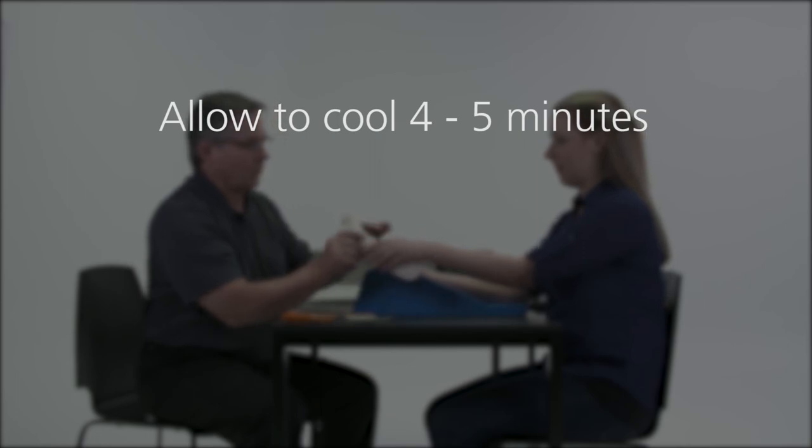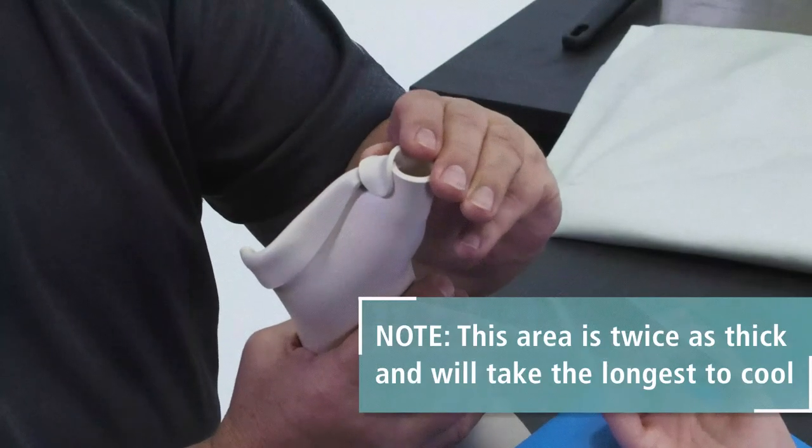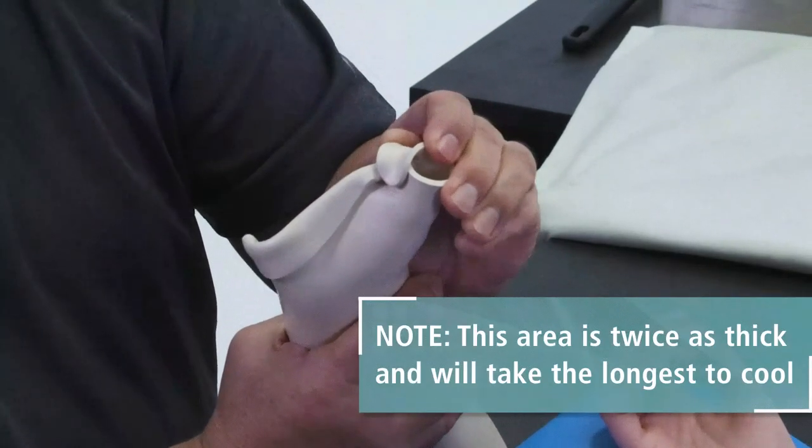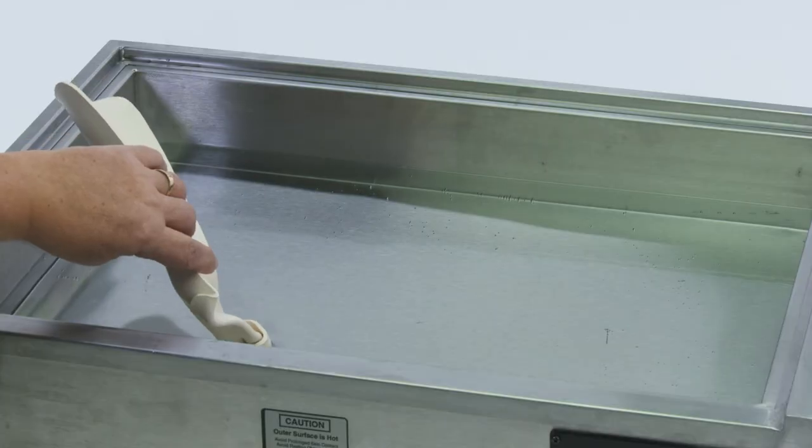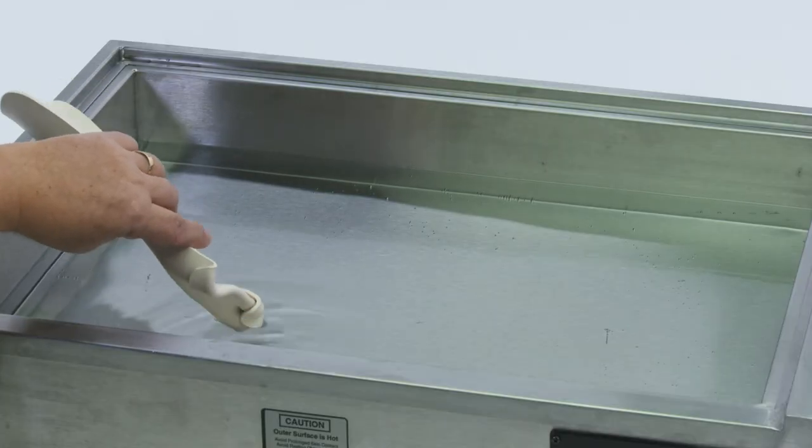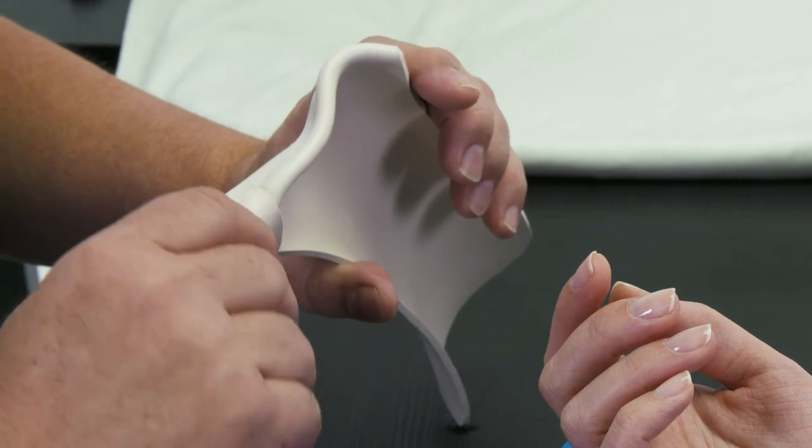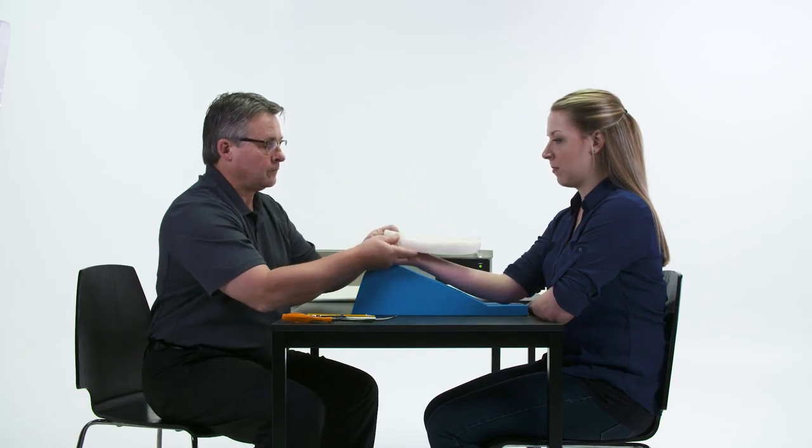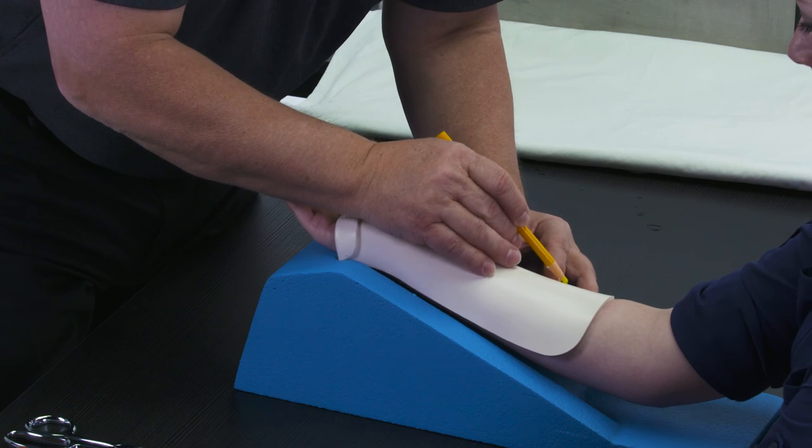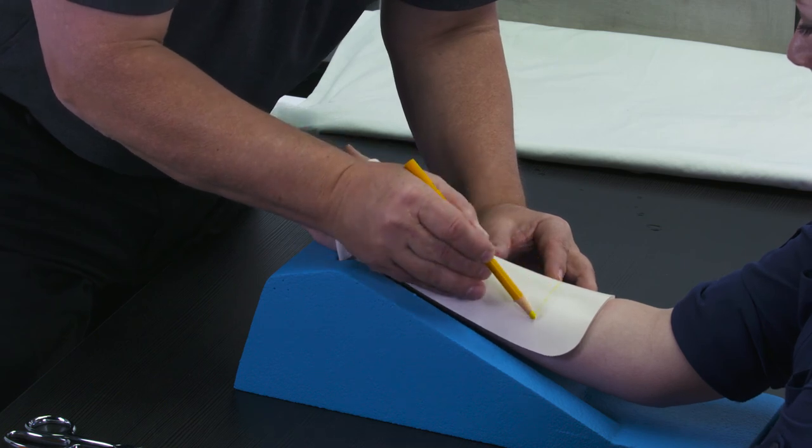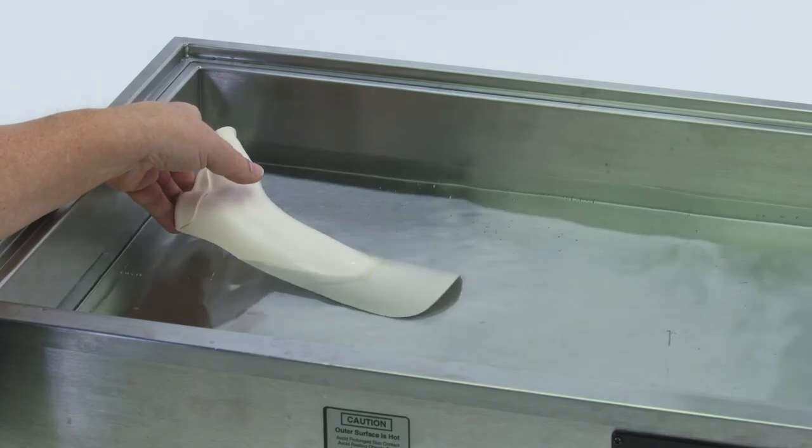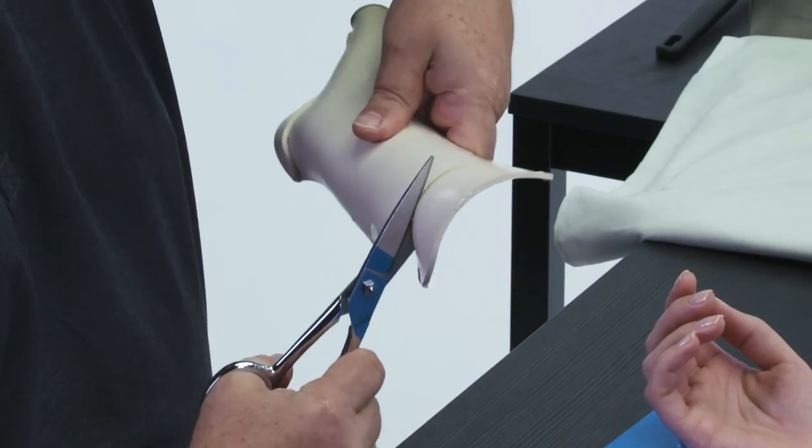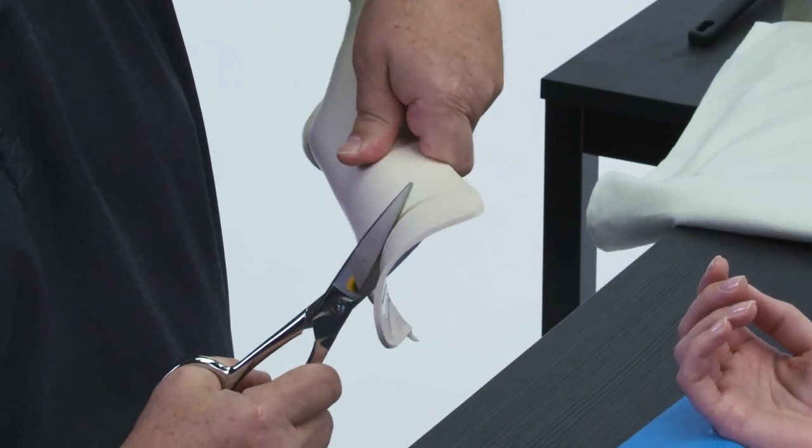Once the splint is completely cooled, the temporary tack at the thumb can be popped open. Dip the distal end of the thumb portion of the splint into the pan for 20 seconds. Use your thumb to finish the edge of the IP border of the splint. The proximal border needs to be ⅔ the way up the forearm and wide enough to be semi-circumferential. Dip the borders of the splint that need to be trimmed for 20-30 seconds and remove excess material.